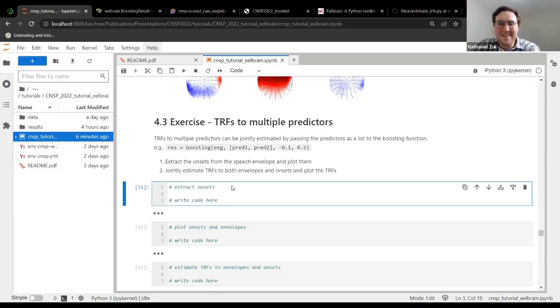So I think I found the function that I should be using to do this, but I'm a little bit confused how to use it. I keep getting errors when I'm trying to run it. I don't know if anybody else was running into that issue. Which function are you trying to use? So I spotted event impulse predictor.